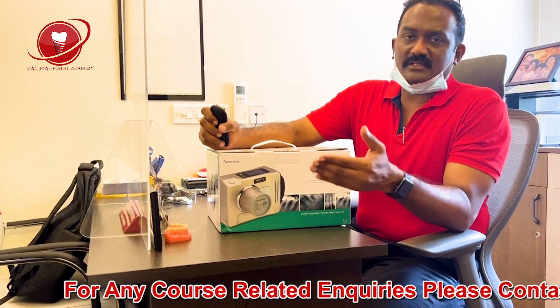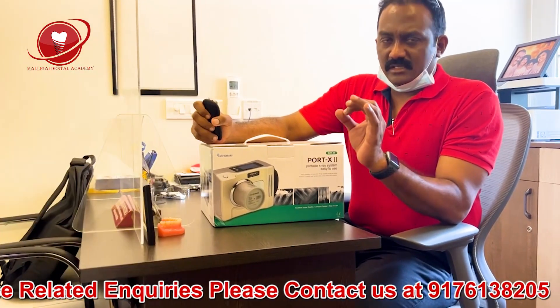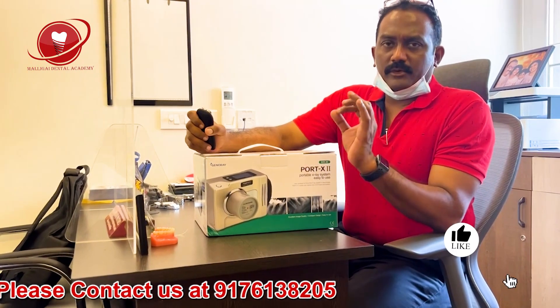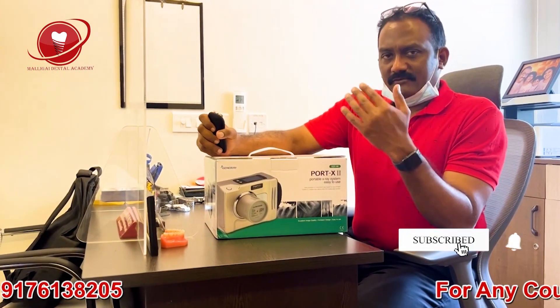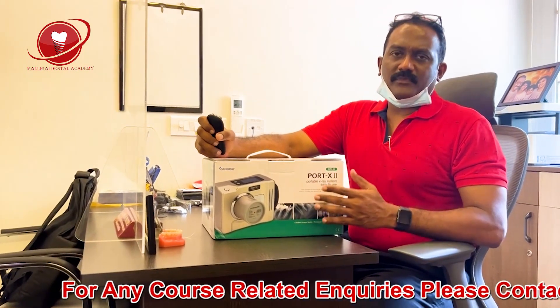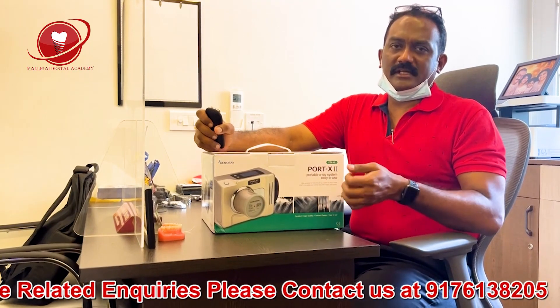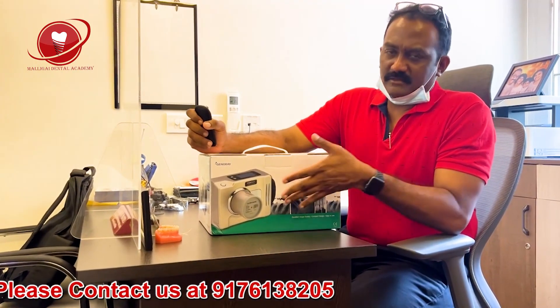This is my second machine. My first machine is a Dexcowin product — an excellent Korean product which has serviced me beautifully for almost 10 to 12 years. Right now I've ordered a battery for my Dexcowin. Since I have two clinics — one on the ground floor with three chairs, one on the first floor with two chairs, and one more practice with two chairs — I need portability, just like how mobile phones are so useful compared to landlines.